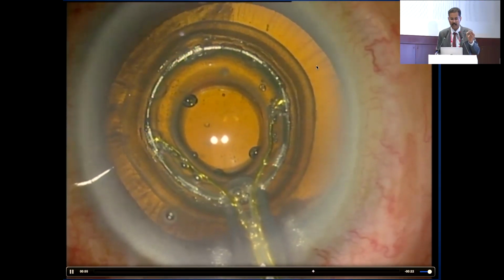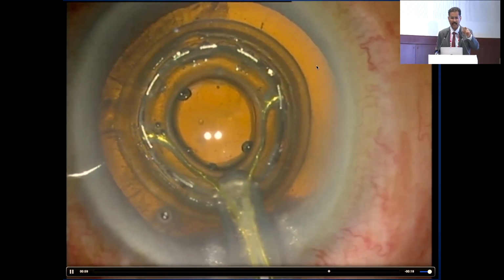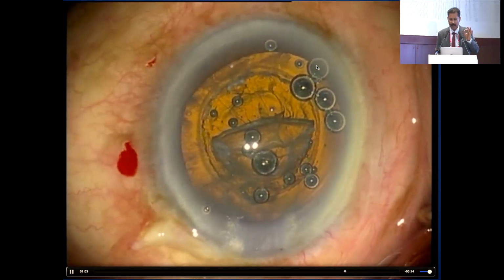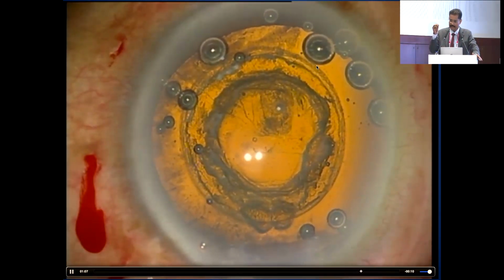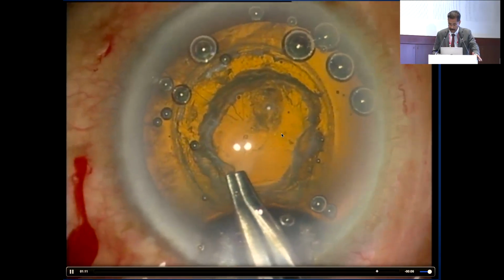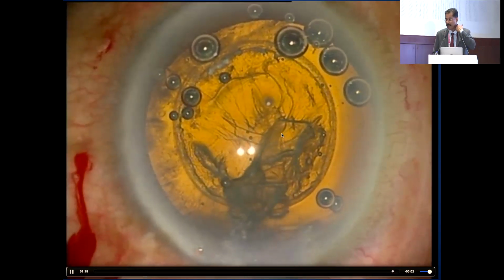See the lines? And then the energy is delivered, and it is so quick, and it is one shot. It makes a complete rhexis with the electrical pulses, low energy, fast electrical DC current which is passed through, and you get a complete rhexis here. And it is simple, easy, and it is cheaper than your Femto, but I don't know, somehow it has lost its fancy.